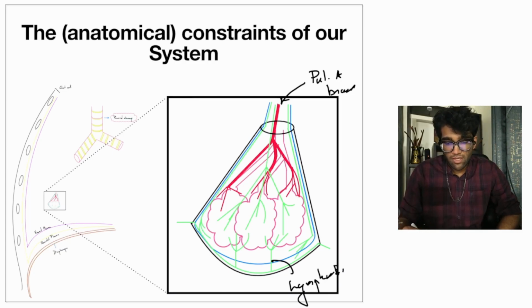Now the venous supply, or the veins that form after the blood has passed through the capillaries around the alveolar walls, passes through the septum. This is how it passes. So this is the detailed understanding of the anatomy of the bronchopulmonary lobule.